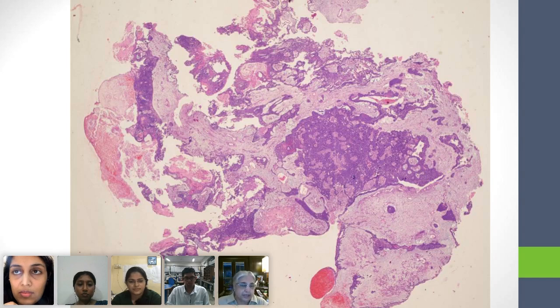So come on, now tell me at low power what you're seeing. And don't say that here I can see stroma and there I can, because I'm blind, I can't see. So now just draw for me a picture that you are seeing, which I should see in my mind. Okay, come on. So we have a tissue bit which is predominantly composed of stroma and the neoplastic part.